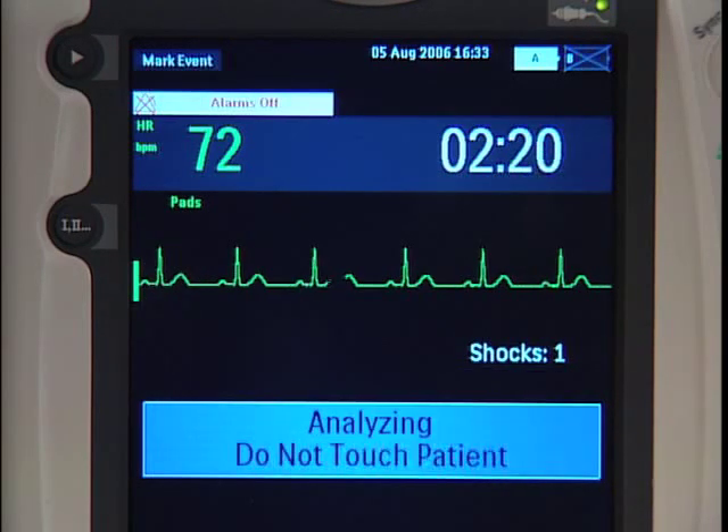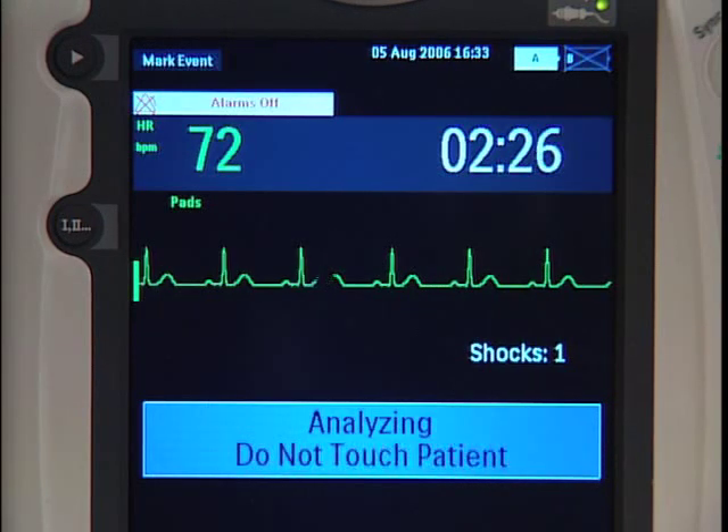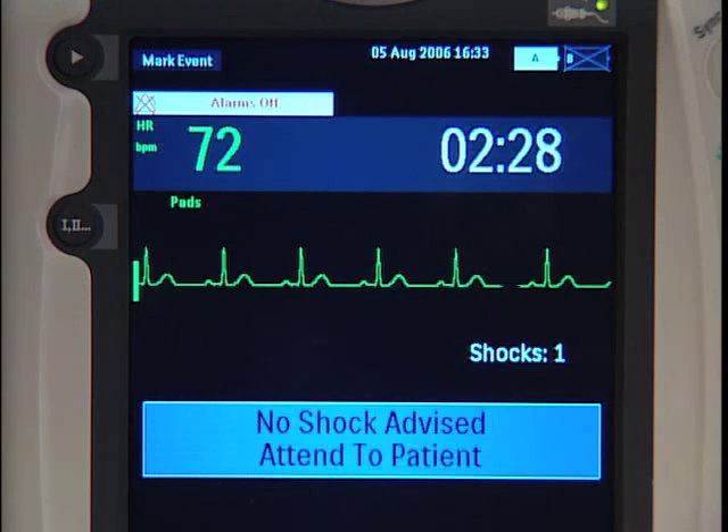Analyzing heart rhythm. Do not touch the patient. If a shockable rhythm is not detected, the device tells you no shock advised.